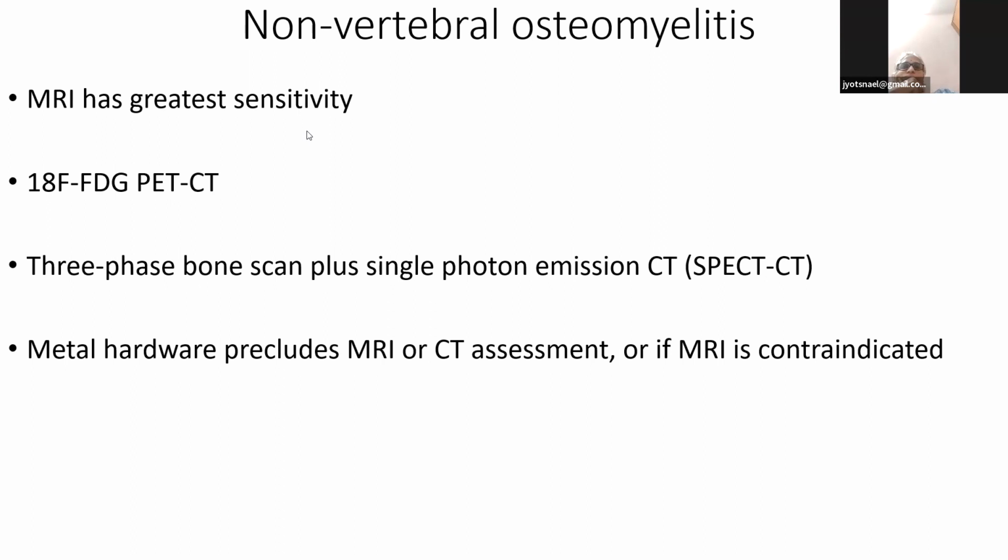But 18F-FDG PET and 3-phase bone scan plus single photon emission computerized tomography are what we have available in our center.